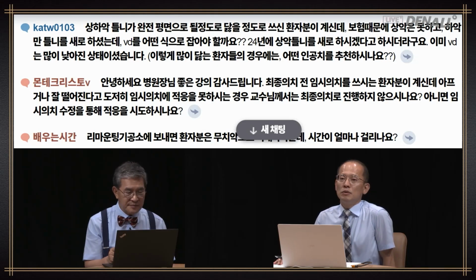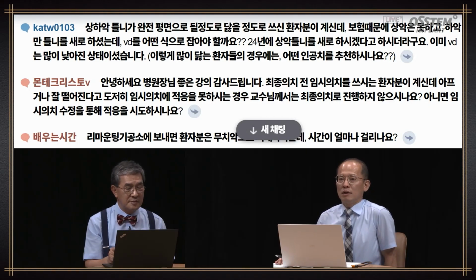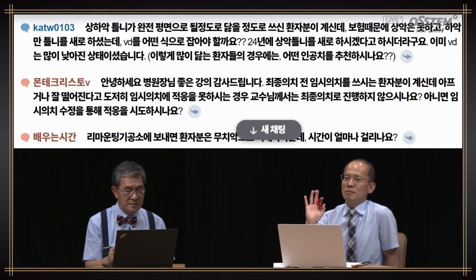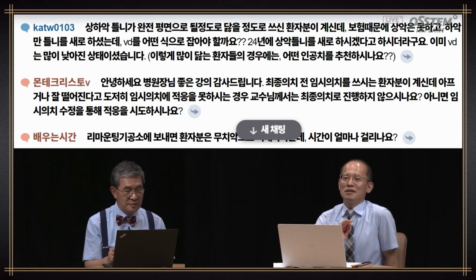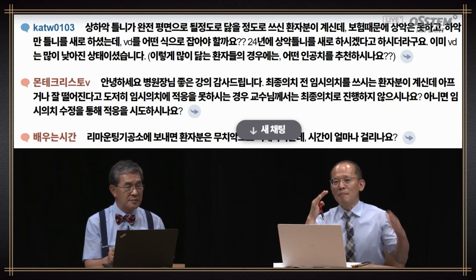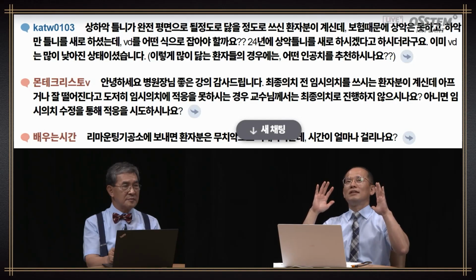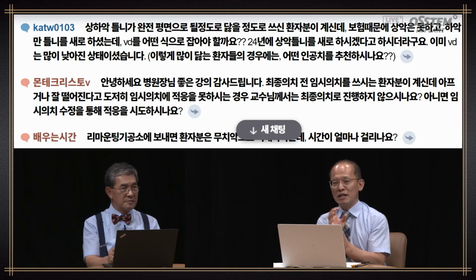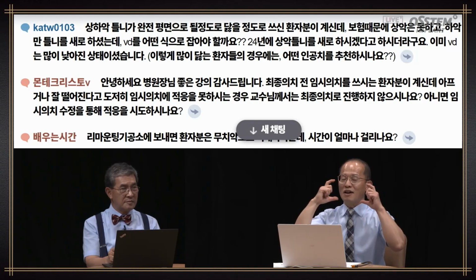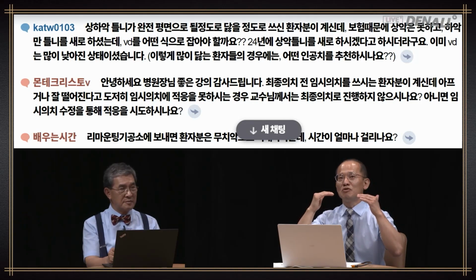For artificial teeth, I think there's a lot of compression, and even with occlusion with the natural teeth, there will be force. Of course, there might be some wear and tear. So I think the strength is there. For this case, without touching the maxillary side, there's not much you can do. But what is most important, I think there is a limitation here, but the point is vertical dimension. You try to watch out for that.